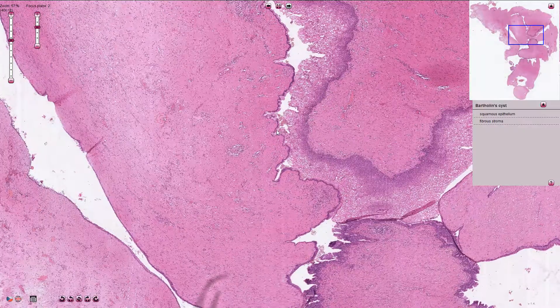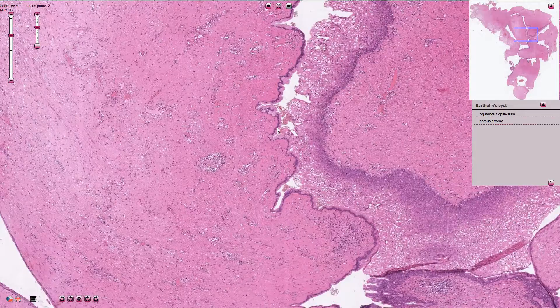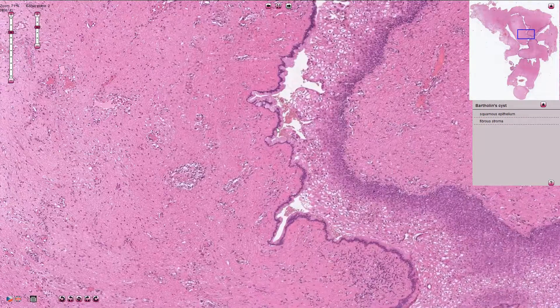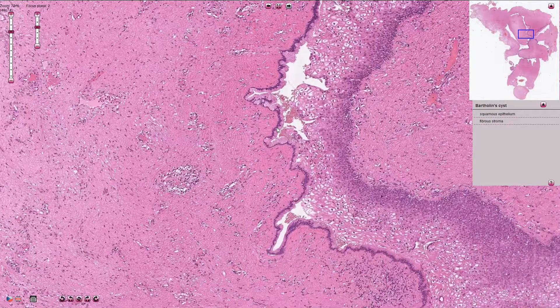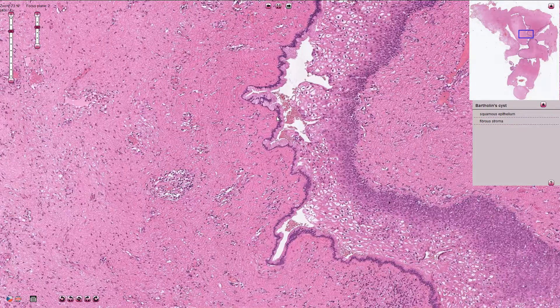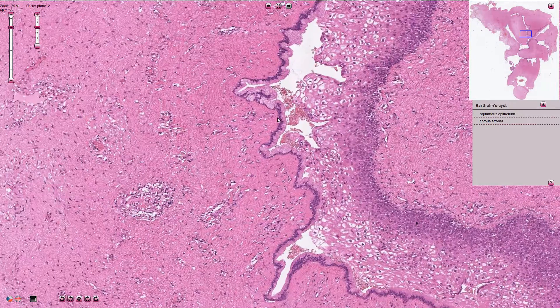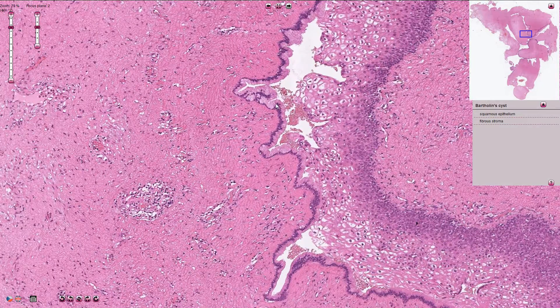Here we have the mucinous epithelium, which is composed of one layer of cells with basally located nuclei and mucinous content in the apical part of the cytoplasm.